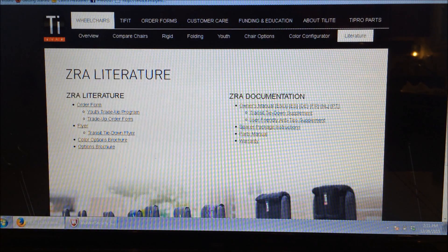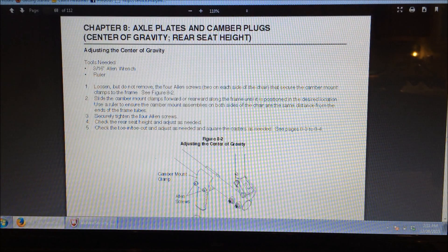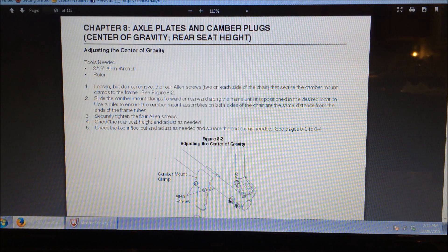I've got Tilite's website pulled up here, and you can go under Literature and Owner's Manual. Pretty much this is exactly what the book that you get — it's just in PDF form. I wanted to show you that in order to adjust the center of gravity, it walks you through the tools that you need and step-by-step how you're supposed to do it. This is for the ZRA Series 2, which is the newer version; I'm showing you on the ZRA Series 1, which you can find that owner's manual separately.